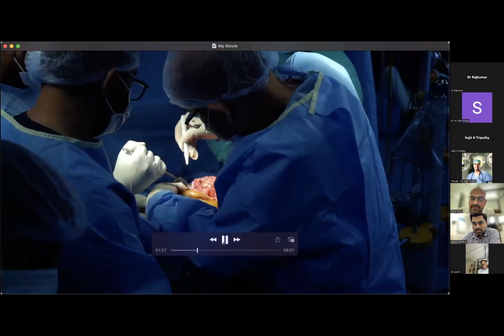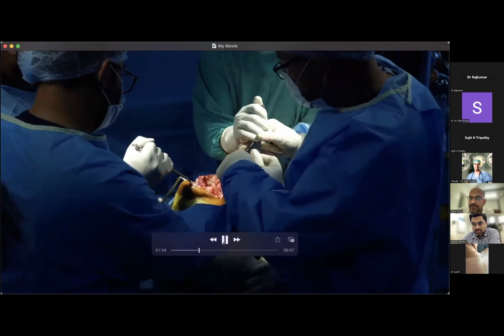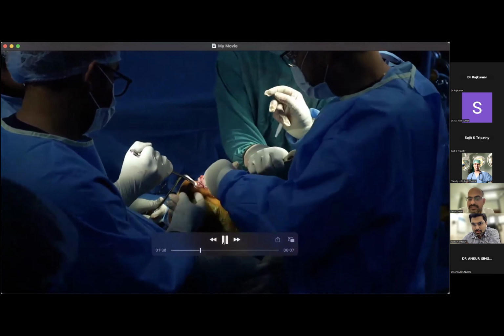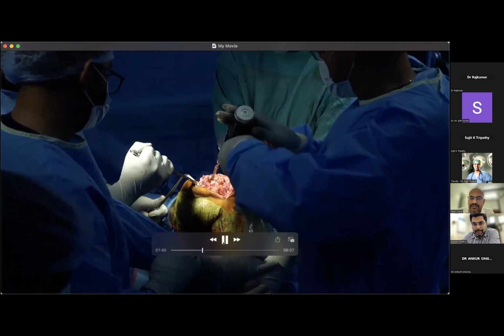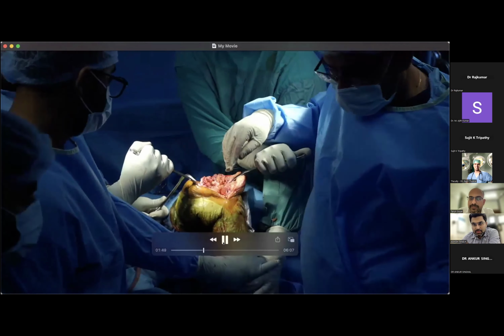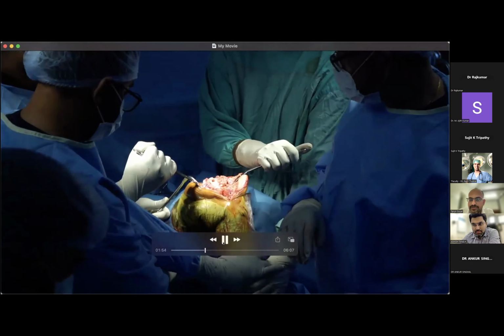Now exposing the femur, we are marking the epicondyles for the rotation alignment, because here, generally on the lateral side, you may see more often bone defects both distally as well as in the posterior condyles. So rotation, if you look at the posterior condyles, may not be reliable. So marking epicondyles will help. This is locating the femur intramedullary canal and sizing the femur in the medial lateral direction. In the anterior posterior direction, it may not always be possible to measure the femur dimensions, because you may be encountering bone loss on the femoral side.